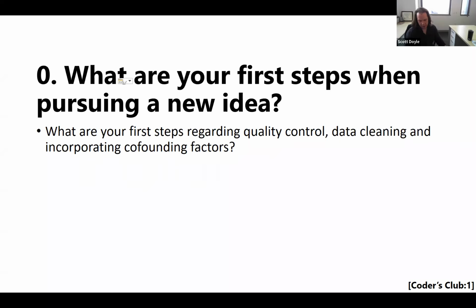So in our projects, what we do is we have them sort of go over the data that they want us to analyze. We usually use the digital slide archive for this. So we get on a Zoom call and we look at a data set of some randomly selected slides. And I have my engineering students on the call to ask the really sort of basic questions about the data and what we're looking at and what kind of features we're looking for. And it's interesting, that conversation, because clinicians often talk to other doctors. And so they will use terms, or they will assume some level of knowledge that a computer or an AI is not going to have.